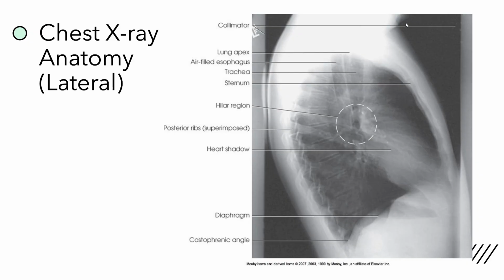So generally we have this bar that sits above the patient when we're positioning somebody for a lateral chest x-ray that they'll hold on to, so those arms are nice and up and out of the way. If they put their arms in front of them, some places will call that adequate, but the problem is a lot of the time when we're looking for lung masses, we're looking at these spaces, the retrosternal space right behind the sternum and the retrocardiac space, because they should be nice and clear and radiolucent like they are right now. Sometimes masses will like to hide there.